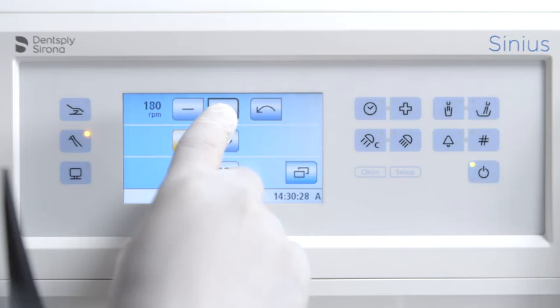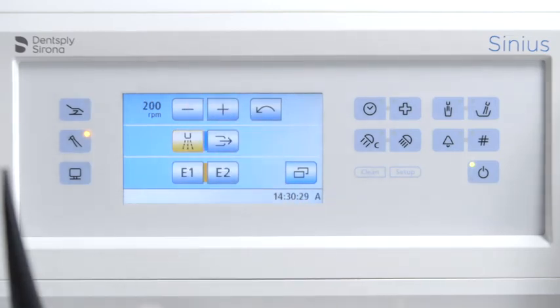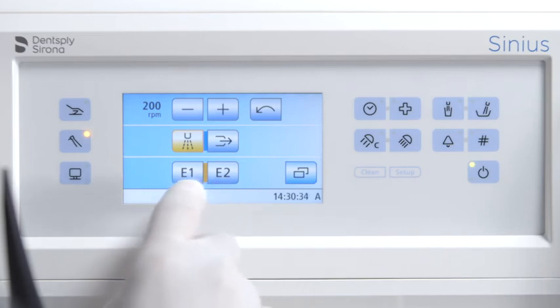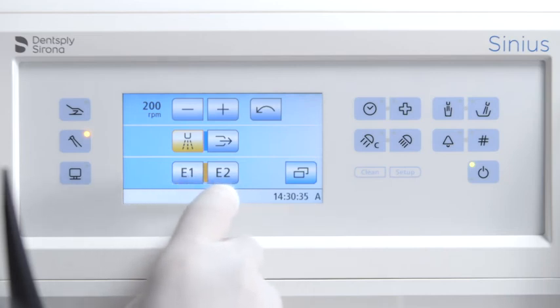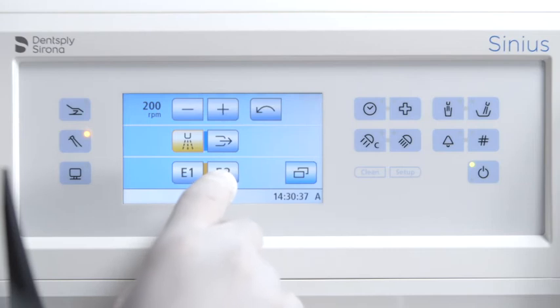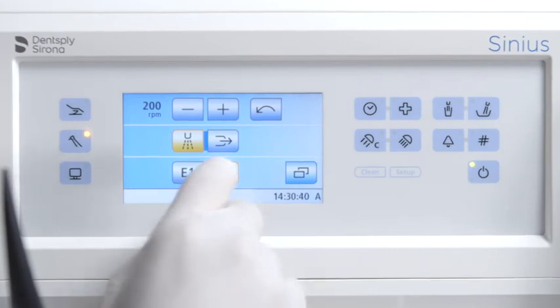When using function levels, you have two storage locations, E1 and E2, for each user profile that can be used to save settings or call them up at the push of a button.